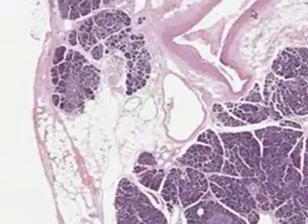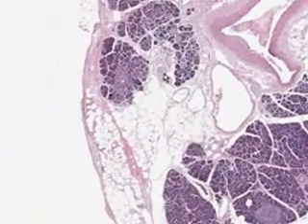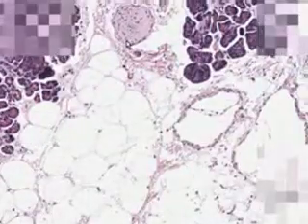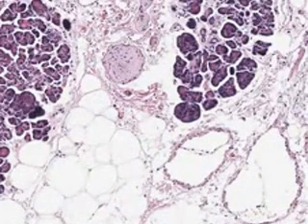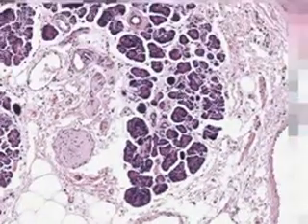Notice the large artery here. And what do you think this guy is? I bet you it's a nerve. Let's blow it up and prove it. Yeah, it's definitely a beautiful little nerve, isn't it? And there's a tiny nerve, and there's a tiny nerve, and there's a small artery, and there's a small artery, and there's a nice little vein. And here's fat, and here are some more veins, and here are some lobules.